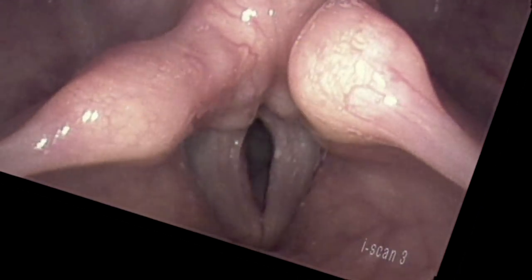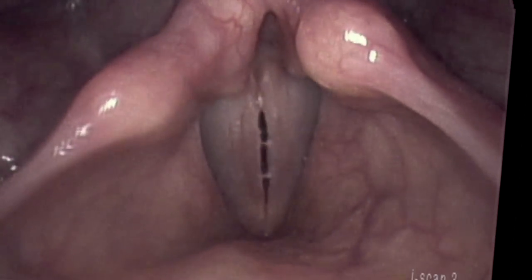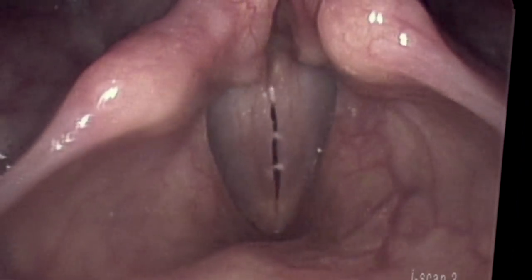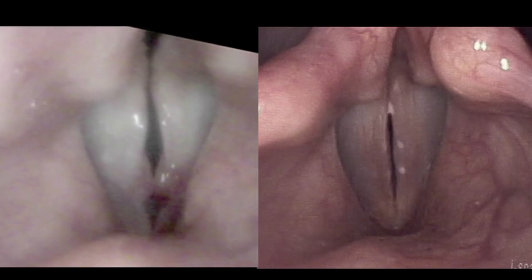Here he is only two weeks later. He's rested his voice. We'll take a look at the vocal cords at low and then high pitches. We'll see that he's still a little bit stiff, but he can clearly come together much better than before the surgery. So a successful outcome, even though we used an older laser.